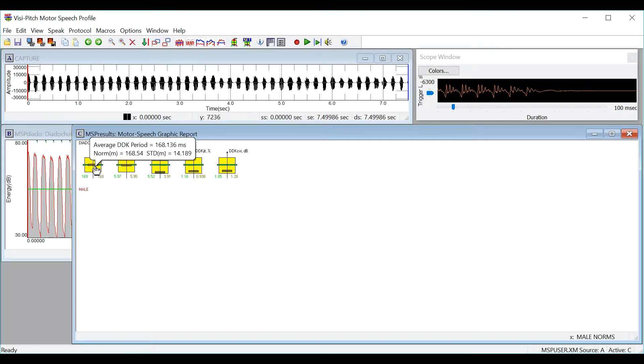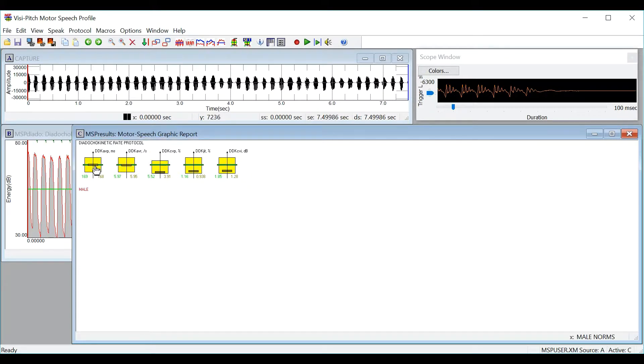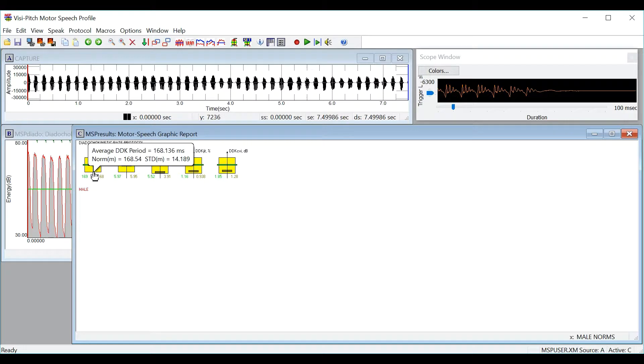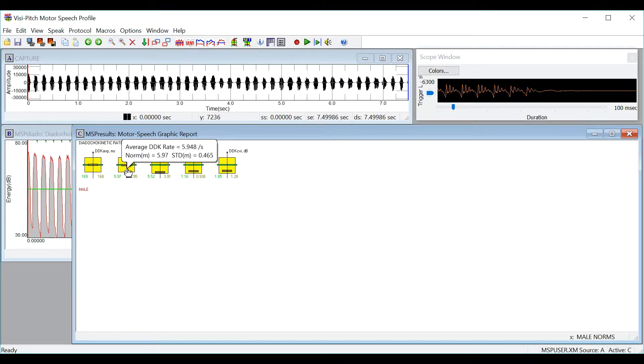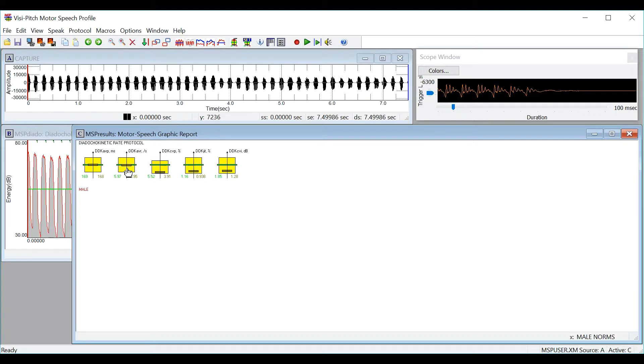So here you can see the average diodokinetic period which is the amount of time it took me to say PA which is 168 milliseconds with the normative data being roughly the same. Here you can see the average diodokinetic rate which says I can do about 5.9 syllables per second with the normative data being about the same as well.